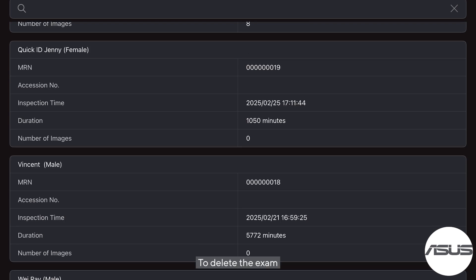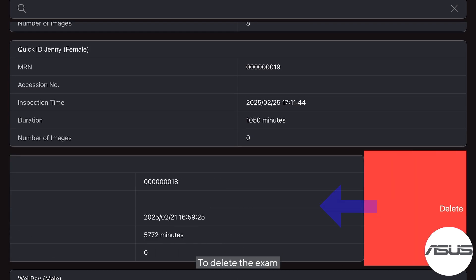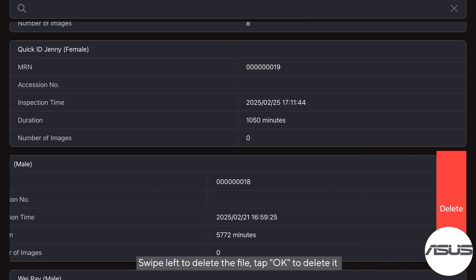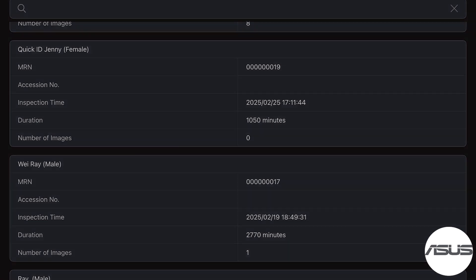To delete an exam, swipe left to delete the file and tap OK to delete it.